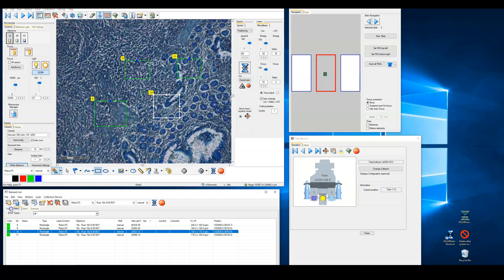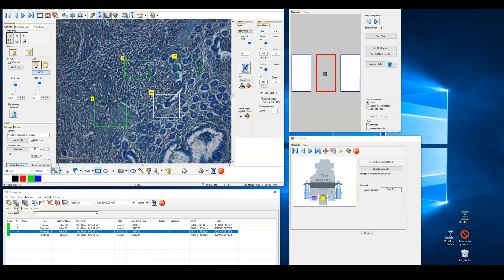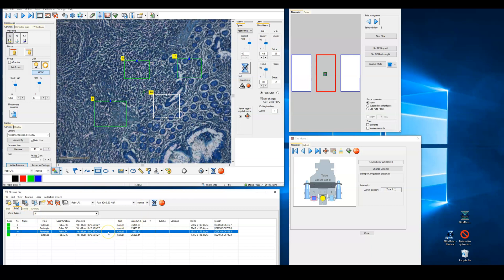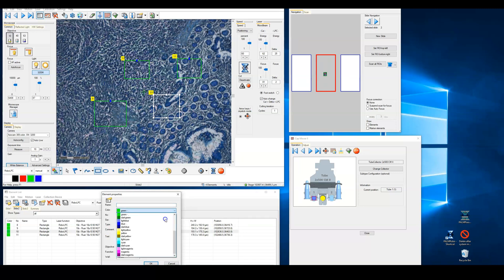Before we begin the cutting process, we can refine the cut list if we'd like. Double clicking on an element will allow us to change the properties of the cutting that is to take place. This can include the color of the element used for purposes of creating cut groups, for example of regular and diseased tissue. You may also find it necessary to change the objective to be used for cutting or the type of cut to be made. More on this type of cutting in a moment.